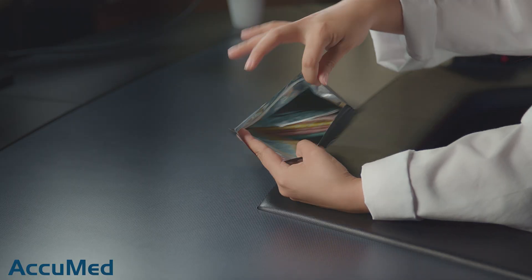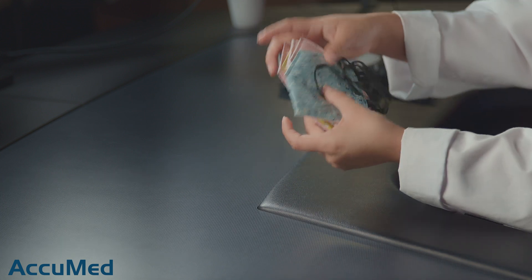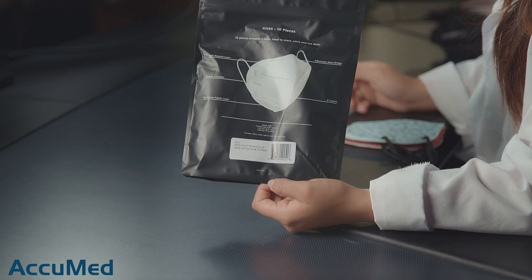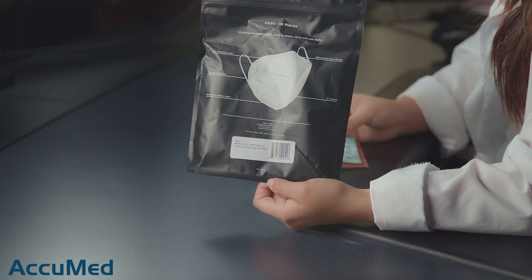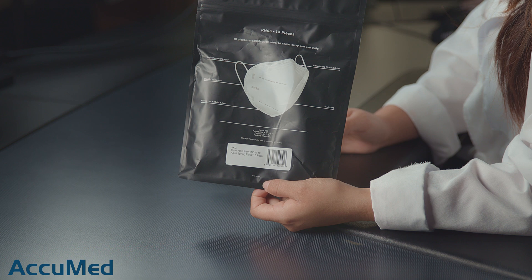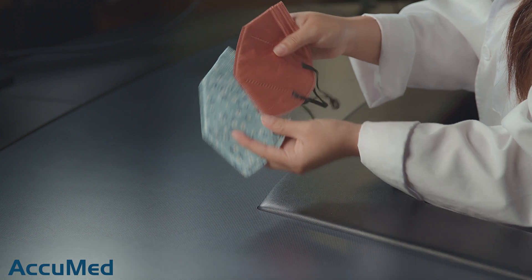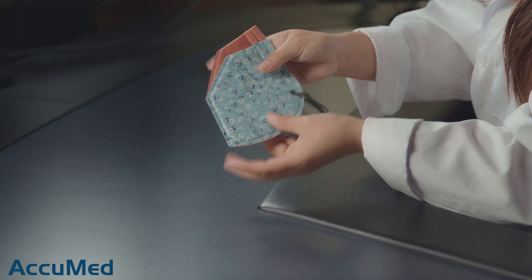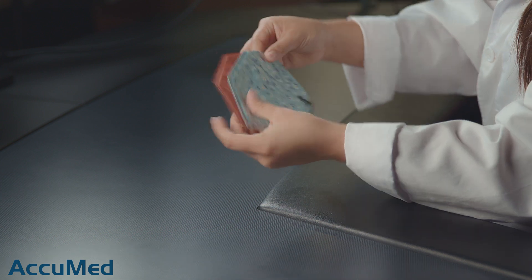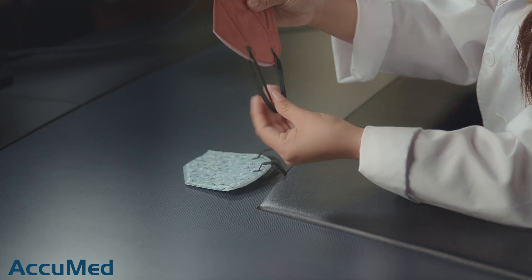So let's go ahead and open these up. They come in a resealable bag. These masks are made in China. This is the clay one and this is the floral print one. They both have a very nice silk outer layer. The colors are really nice and it's very fashionable.